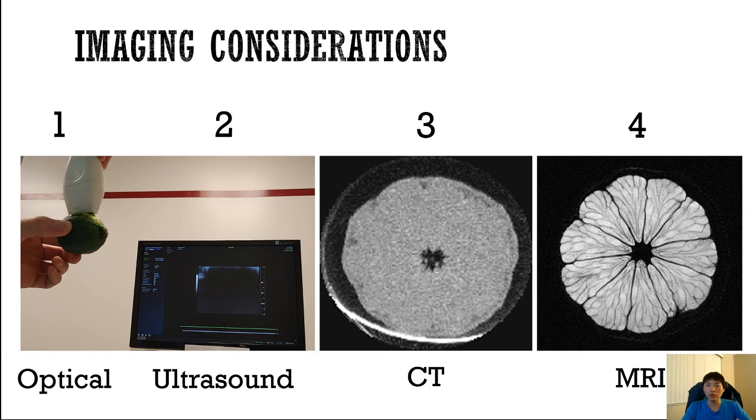And so it's quite a quicker imaging session compared to MRI, which can take anywhere from half an hour to an hour, and sometimes even more. So it takes quite a long time to acquire MRI. These are different trade-offs that you have to consider when you're choosing which imaging modality to use to look at specific diseases or conditions of your patients.